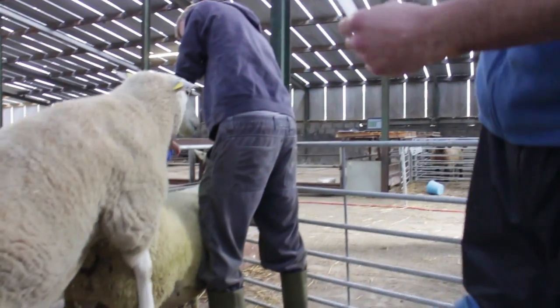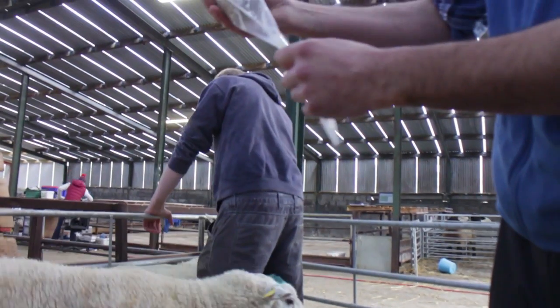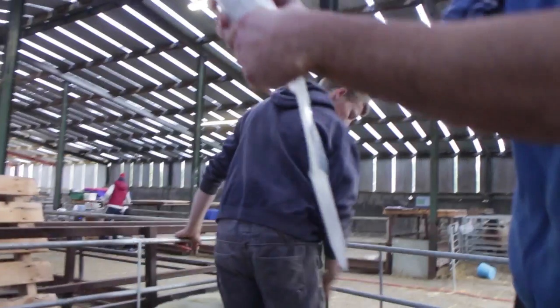The ram was very obliging. The semen has run down the sides — it's a good collection.